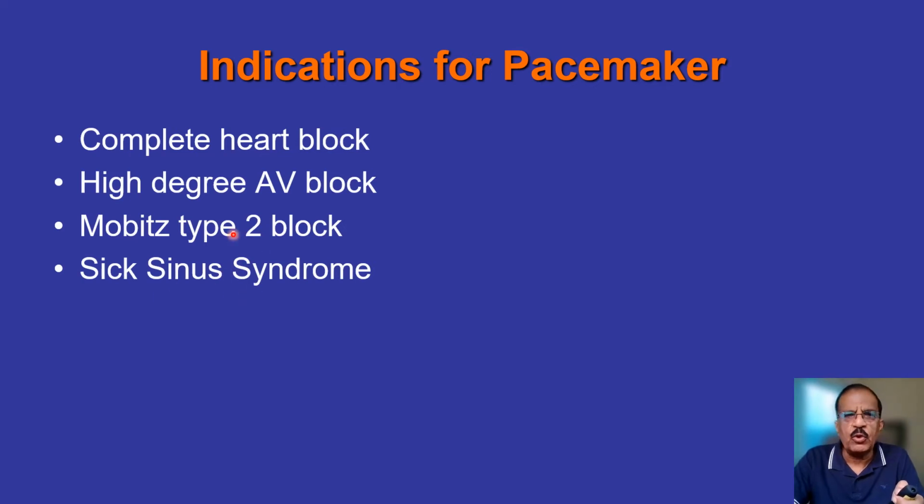Then sick sinus syndrome. I think if the cardiologist feels that this second degree block is likely to progress to third degree, that is the indication for pacemaker. Third degree, of course, is the indication.